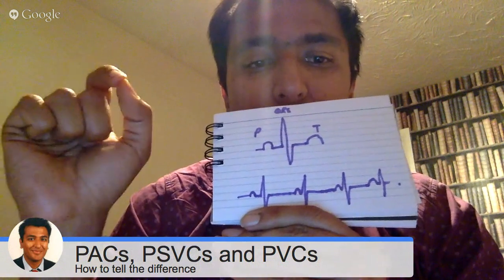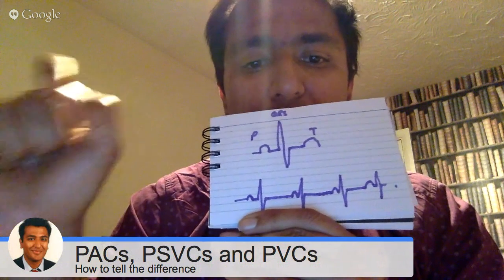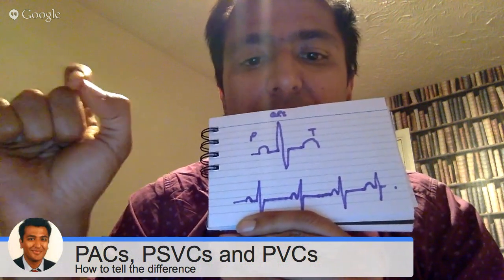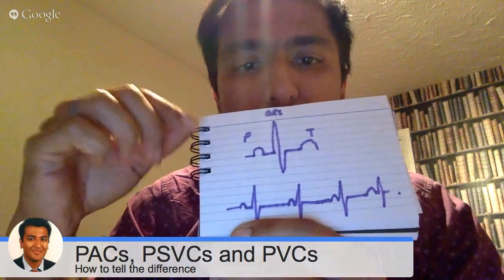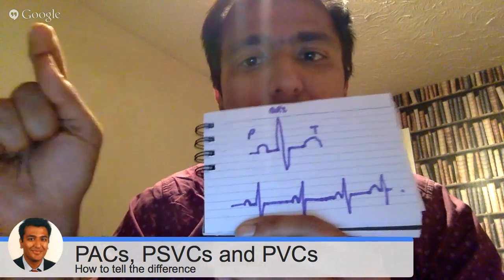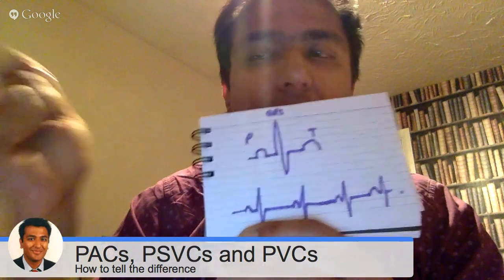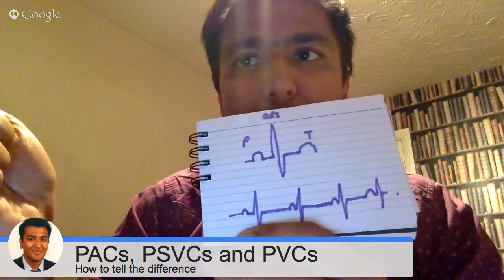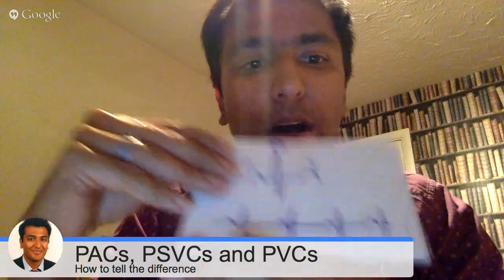Now, PACs stand for premature atrial complexes. PSVCs stand for premature supraventricular complexes, and PVCs stand for premature ventricular complexes. So by definition, they have to be premature, which means that they have to occur before the echo has died down, i.e. someone else fires before the echo dies down. Okay, so the guy, your pacemaker beats the drum, but before the echo dies down, someone else fires. And that is the hallmark. They are premature.